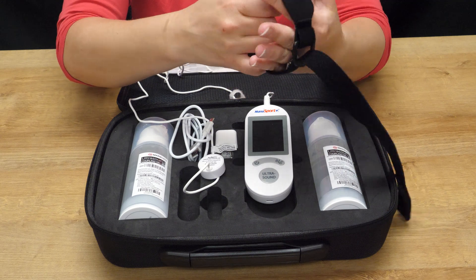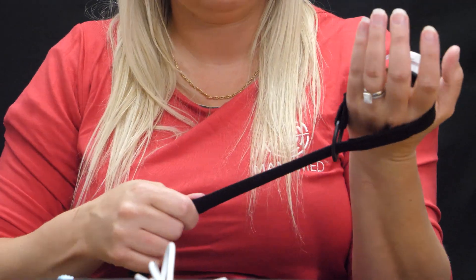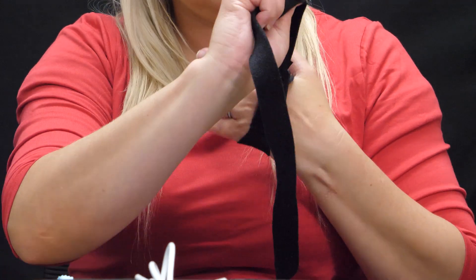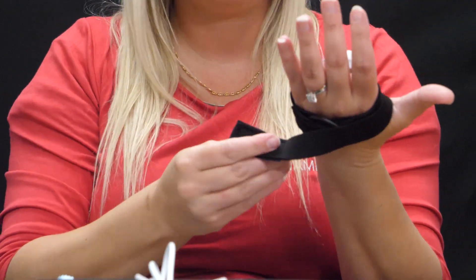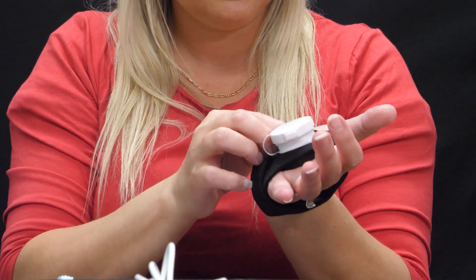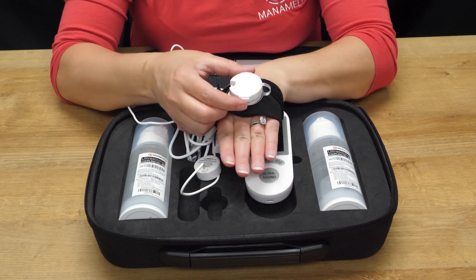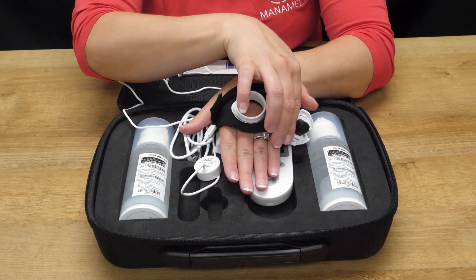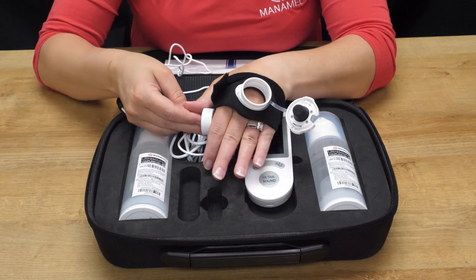The strap itself will go on the body part it has been prescribed for. You want a fitted, not tight, feel — you want it to be able to move, but not so tight that it's painful. You'll take the two buttons on the side, squeeze them together to pop it open. You should have skin visibility right through there.